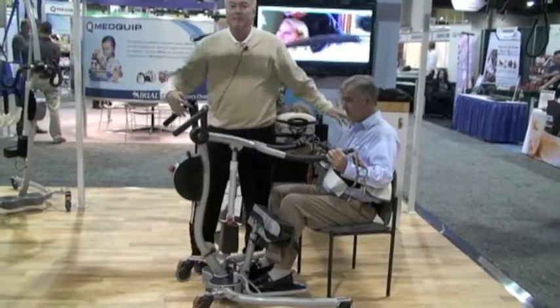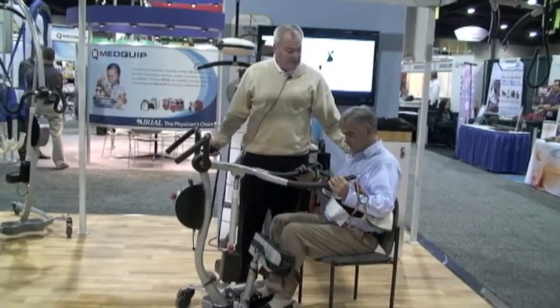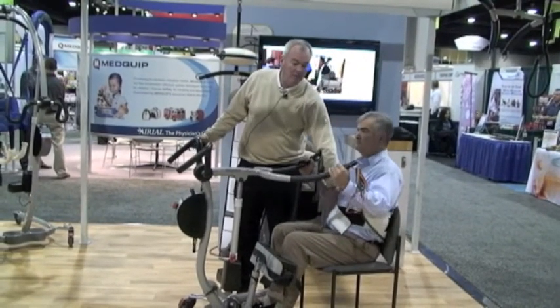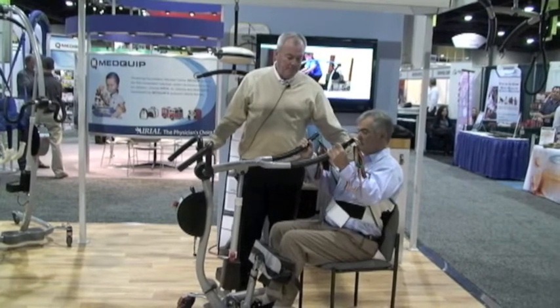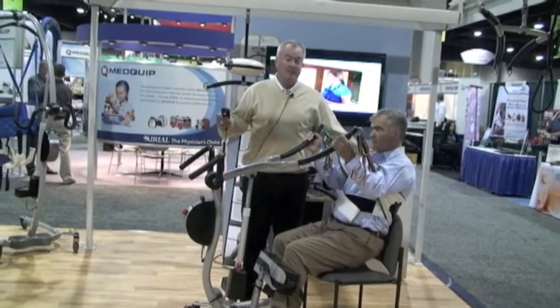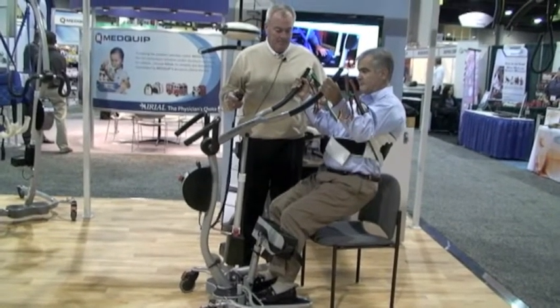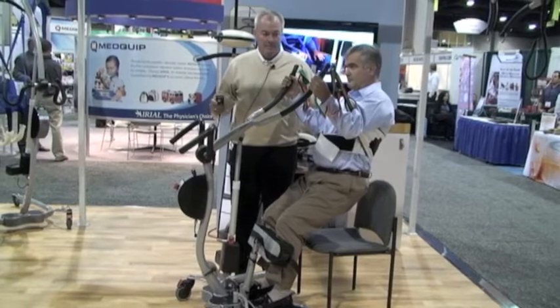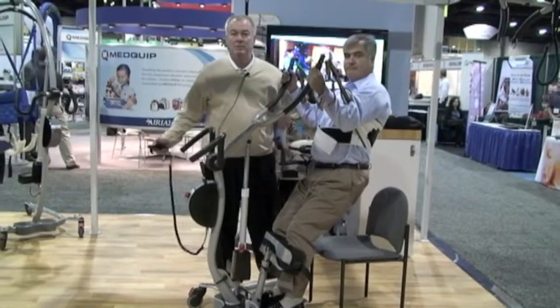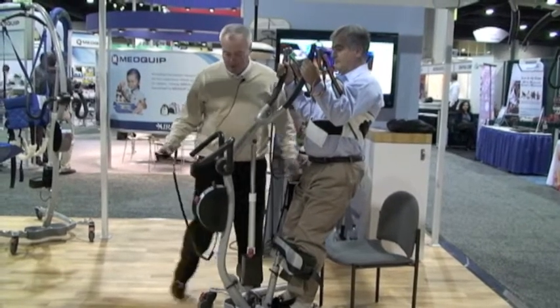I like to stand next to my patient when standing them up with this particular machine. I'm going to ask the patient to lean back in the chair, and here we go. As you can see, it stands them up to a nice standing position. This is a single patient use sling — disposable — so it will stay with that particular patient while they're here.